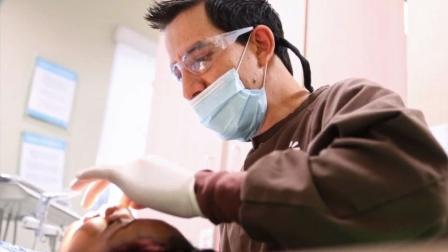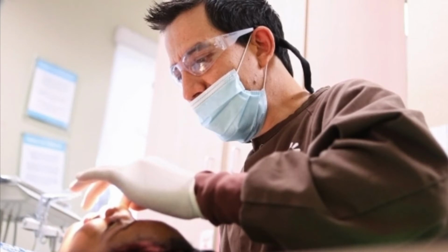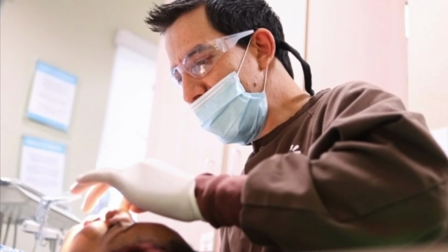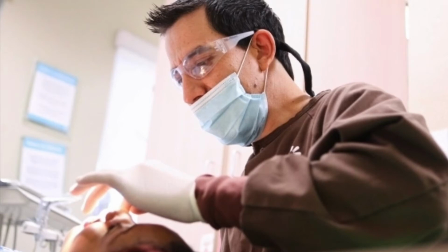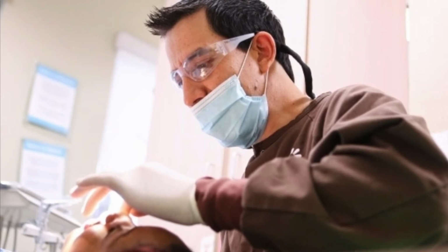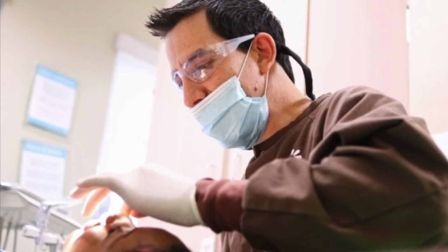Here we have to make a determination of the working length of the tooth. The working length is the distance from the incisal edge of the tooth or the tip of the cusp to 0.5 millimeter short of the radiographic apex. Again, from the cusp to 1 millimeter short of the radiographic apex.